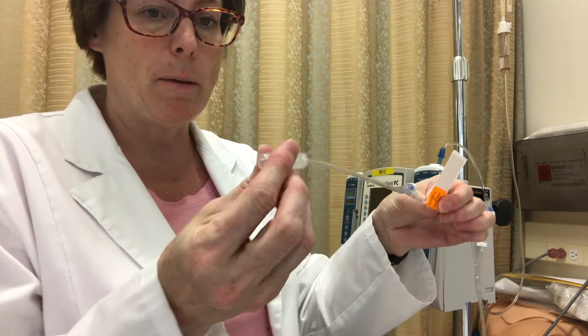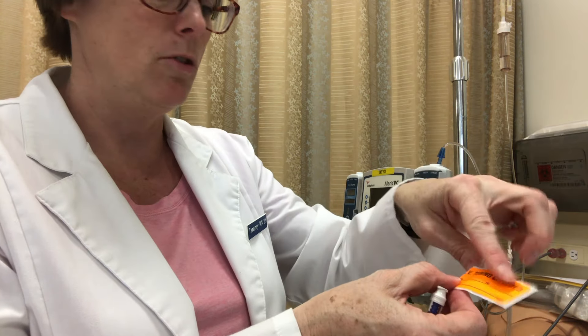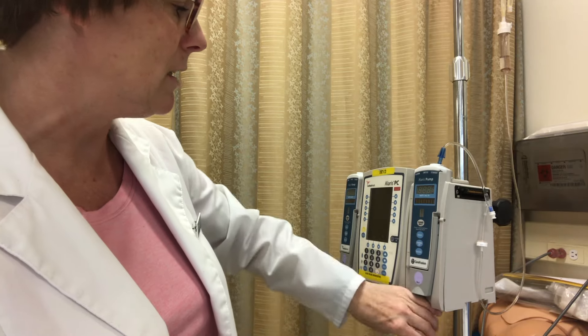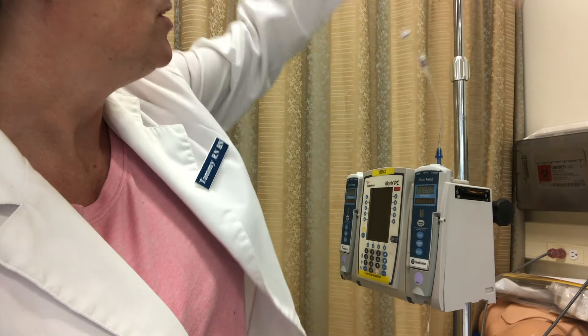Part of your checks would be from the patient — normal saline — and you check that line all the way back, physically holding it right through the pump to the bag, to make sure it says normal saline.